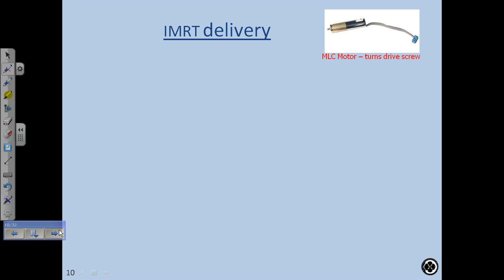The dot decimal came back, and the bottom of the dot decimal was flat, but the alpha cradle conformed to the hand, so we had to remake alpha cradles to fit it, which means that the dot decimal wasn't the same shape, because the hand wasn't the same, and it was just a horrible mess. So you used the compensator to treat a hand? Yeah. It was just a right index finger that they were treating the top half of and did not want to treat the bottom half. We don't know.